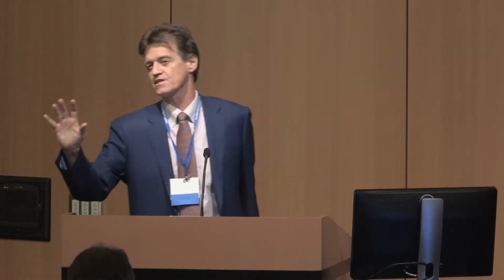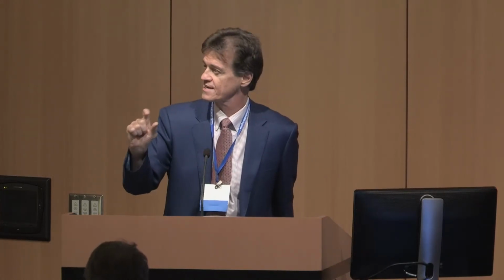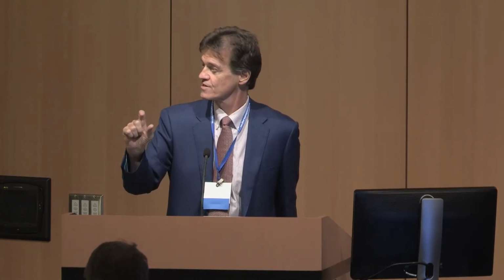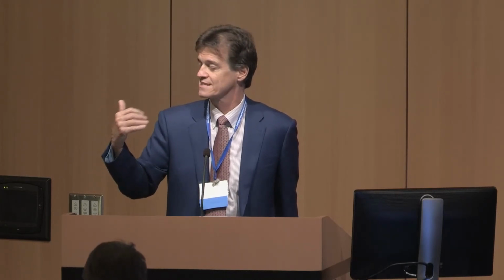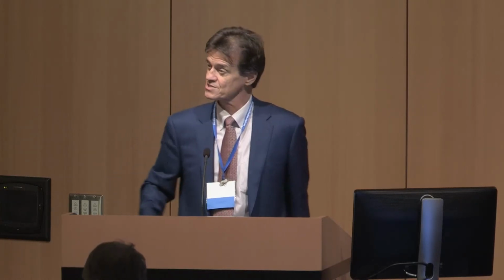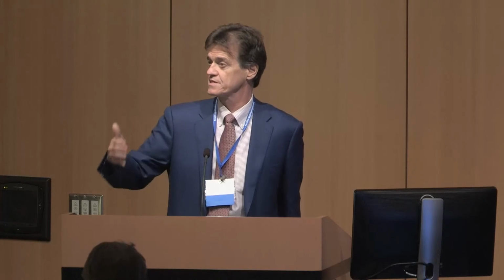So to me, these companies, those ladies have small ventricles too. Remember I said the devices are like a beer can? What they need to develop is a small profile valve that will sit safely inside of MAC and anchor in there, not protrude down into the LV, so that we could at least offer palliative help to those people. And it has to be transseptal, transfemoral, small. That's where the companies need to develop something. They're far away from that right now.